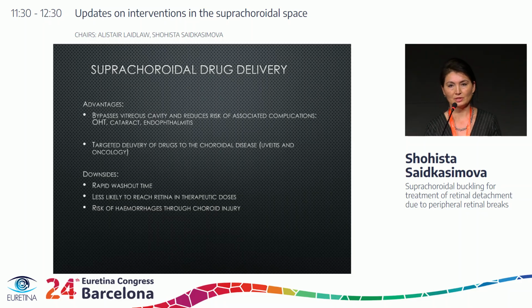And because of that, this space is probably best designed for delivery of the slow release medication, and triamcinolone crystals are probably quite well designed, but Siggy will later on tell us about the use of slow release devices as well in the suprachoroidal space. And also the downside is the tissue being highly vascularized. It's prone to hemorrhagic complications if the vessels were damaged. So using sharp instruments is probably one of the major risks for inducing the problems.